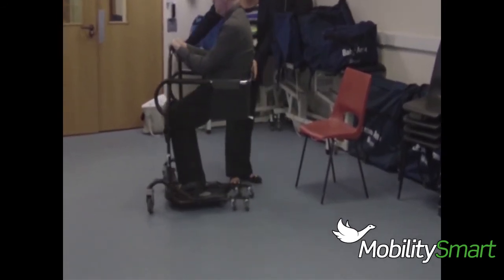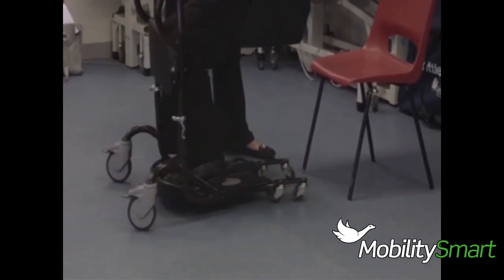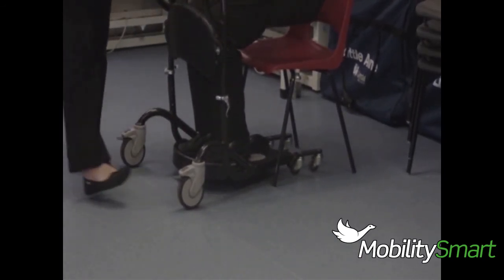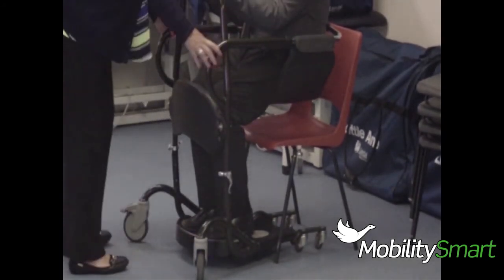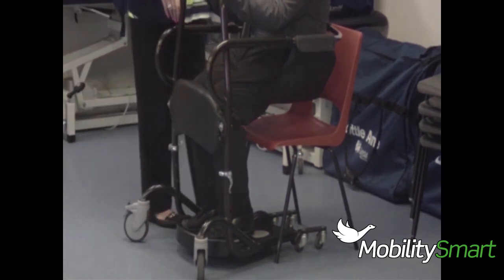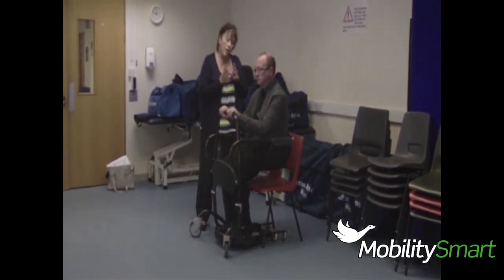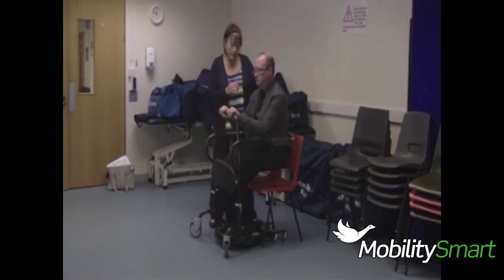So to transfer somebody back into a chair, bed, toilet, whatever, you just bring them back. We can see now at the side exactly where the bottom's going to go when the transfer takes place. Again, we put the brakes on. Now, when we do the full stand, that's great, and that's what we want people to do. But with the Cricket, if somebody can't achieve a full stand, they don't actually need to. I can just ask you to lean forwards a little.